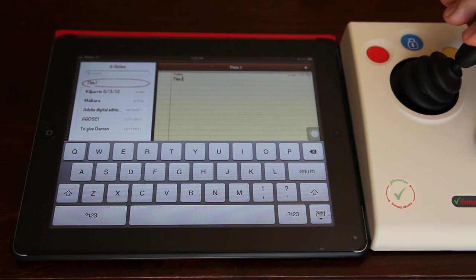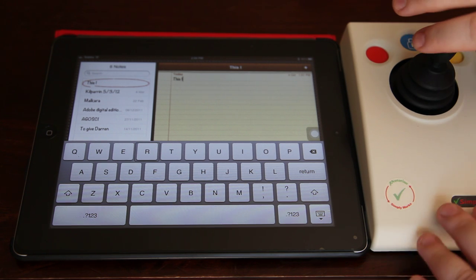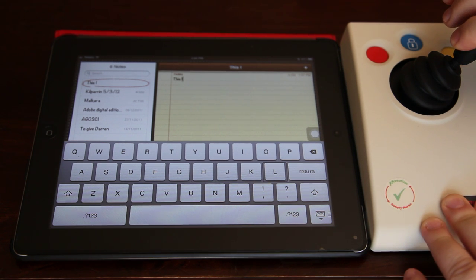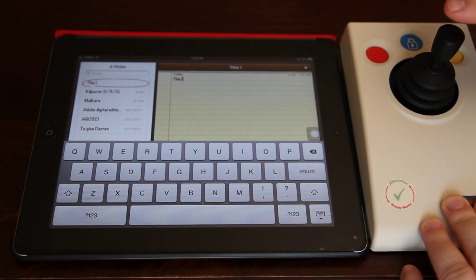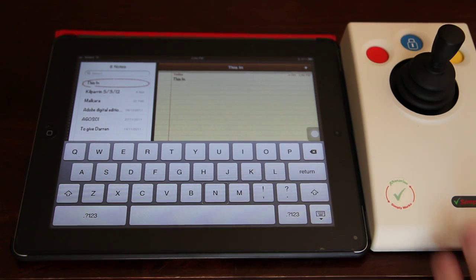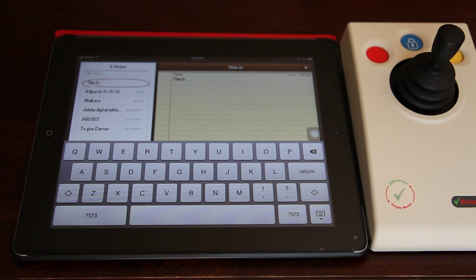Now that I've got the on-screen keyboard up, I can once again control it. I can just hold the knob all the way to the right and it will scan through the letters fairly fast. Then I come off when I get to the one I want and I press the red button to select it. So that's an overview of how the SimpliWorks joystick works with the iPad, and I hope that's been helpful.